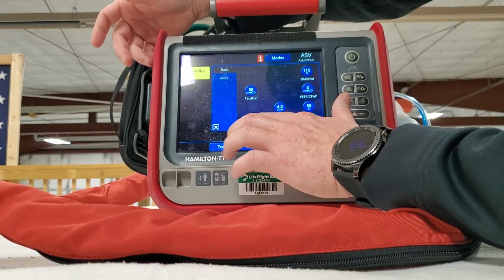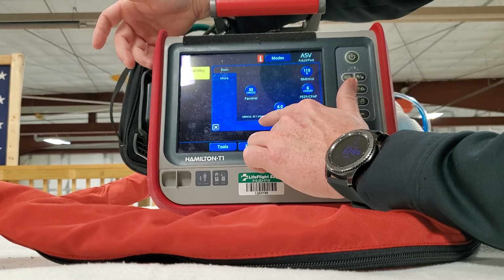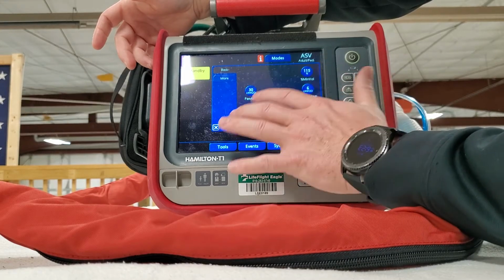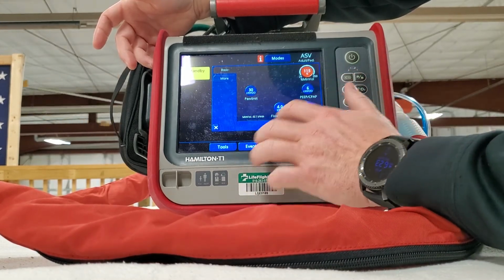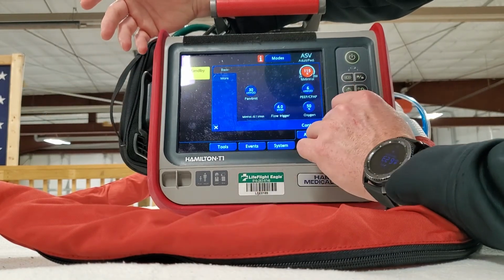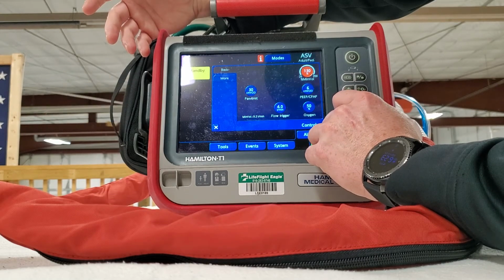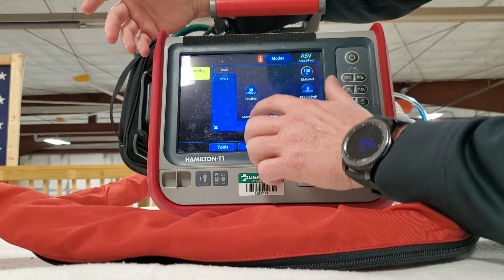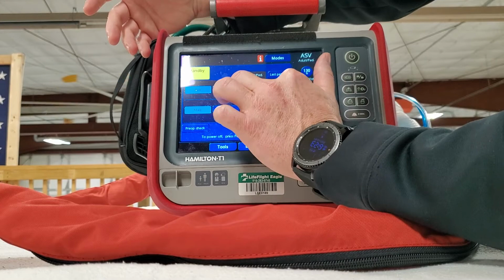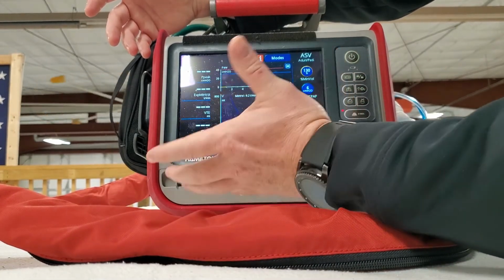What's nice to see here is it calculates for you the minute volume that you're giving. So if you do your math prior to putting them on and you realize that you have X amount, this right here will tell you what you're shooting for. If you're shooting for 8 liters per minute for minute volume, you're good to go. But say you wanted a little bit more, you would increase your minute volume, and it tells you that right there. And then once you've got everything set, you would hit start ventilation. It gives you this nice screen.